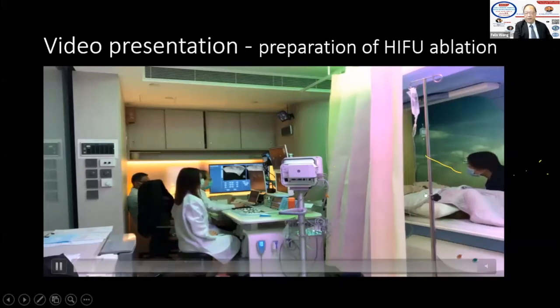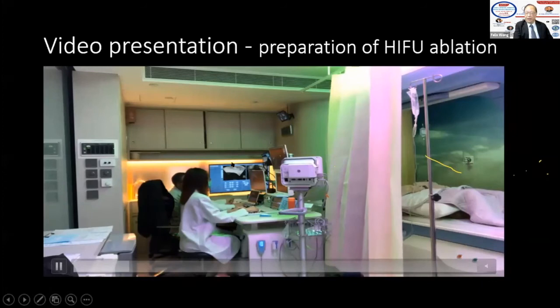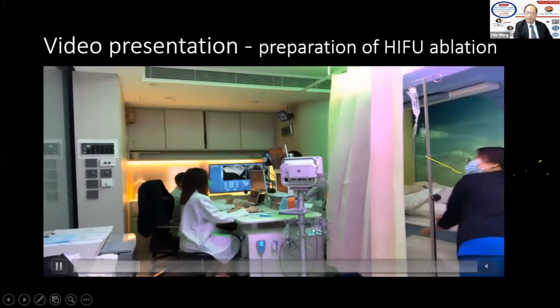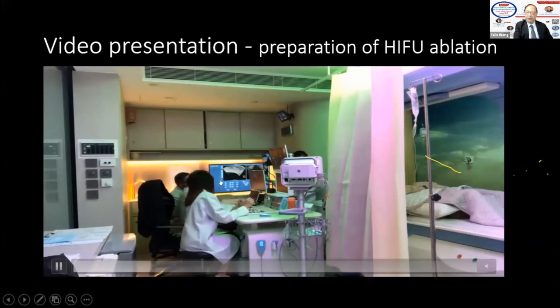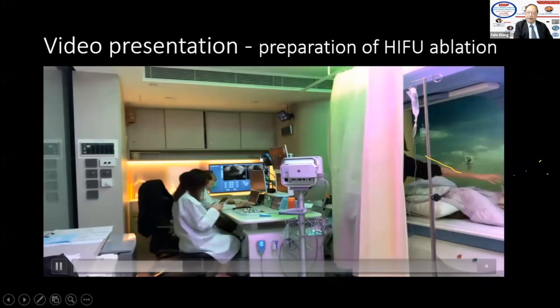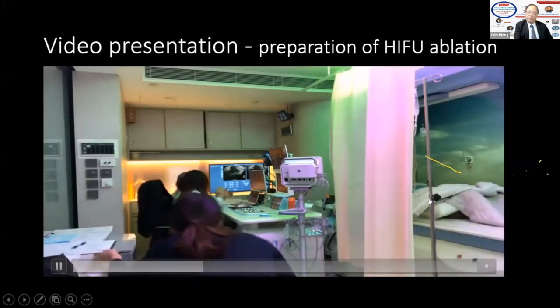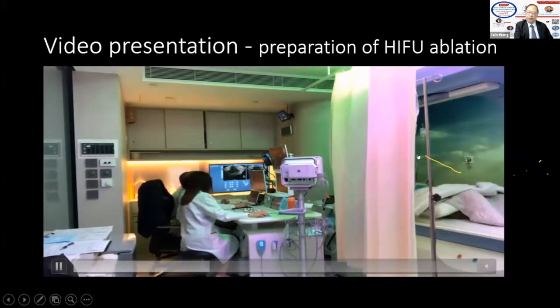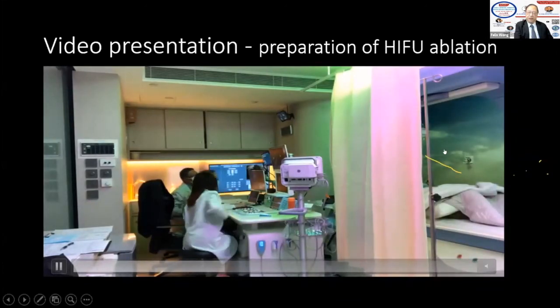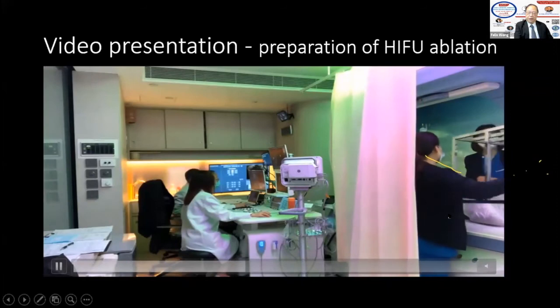Within the theater, you can see while we doctors are discussing the case, how we go about it, and you'll notice that there's a large television here. I allow the patient some time to look at it and also explain to them what I'm doing, rather than just doing it ourselves. You can see my setup here, my infrared monitoring is over here. What the nurse is going to set up is a frame over her buttock so that we can put the infrared camera around here. So now you can see what the nurses are preparing.